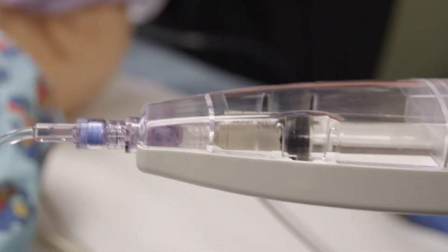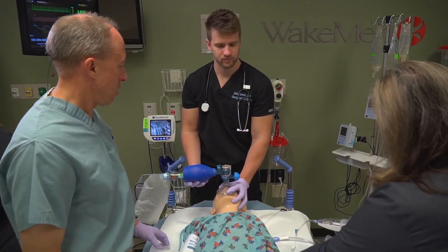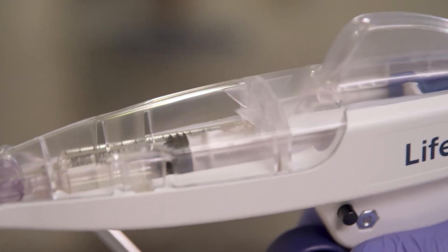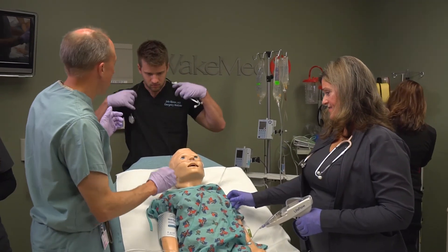The beautiful simplicity is it does exactly what we need and it's not super complicated. It's simple, it's easy, it's fast. You need something easy to put together, easy to work, easy to count — and that has absolutely been the Life Flow device. For a product like this, once you've seen it, once you've used it, I can't think of any reason why you would not want to have this in your emergency department.